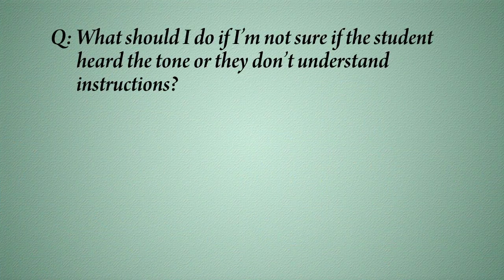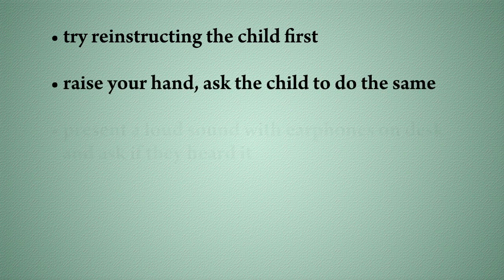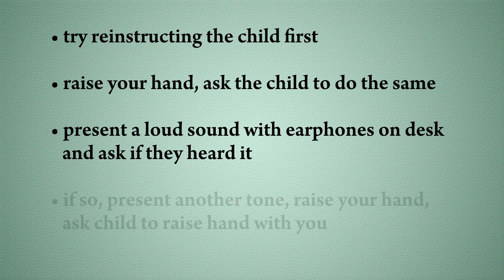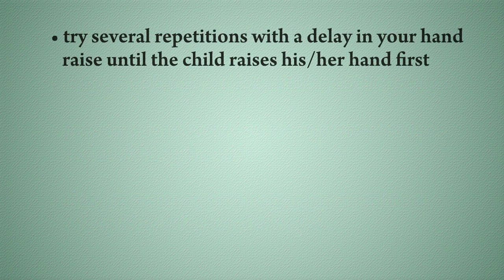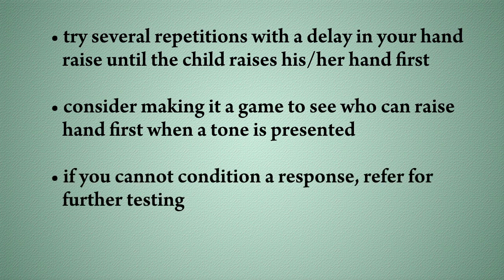What should I do if I'm not sure if the student heard the tone or they don't understand the instructions? Try re-instructing the child first. Raise your hand and ask the child to do the same. Then present a loud sound from the audiometer with the earphones on the desk and ask if they heard it. If so, present another tone and show the child what to do by raising your own hand and asking them to raise their hand. Try several repetitions with a delay in your hand raise until they are raising their hand first. Consider making it a game to see who can raise their hand first when a tone is presented. If you cannot condition the child to respond, then they should be referred for further testing.